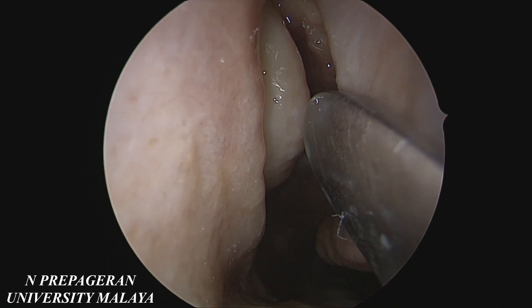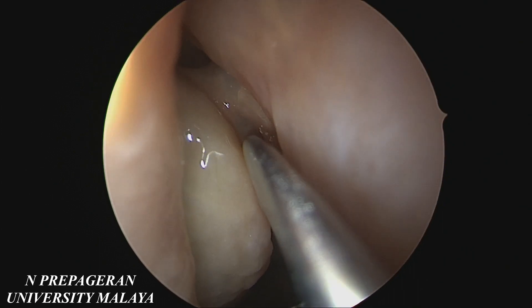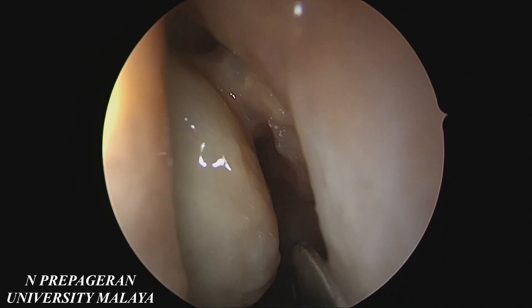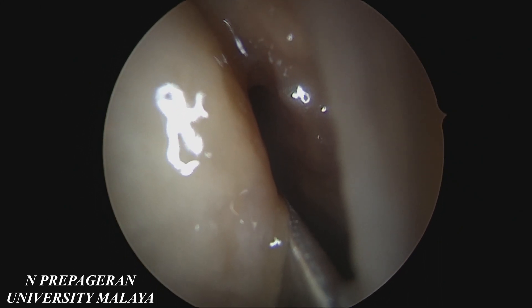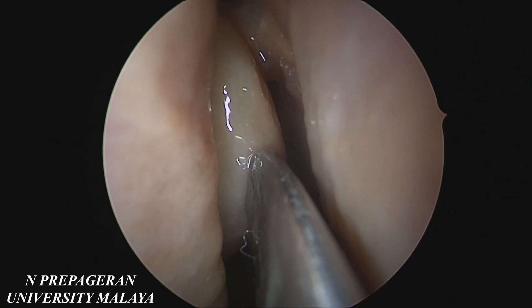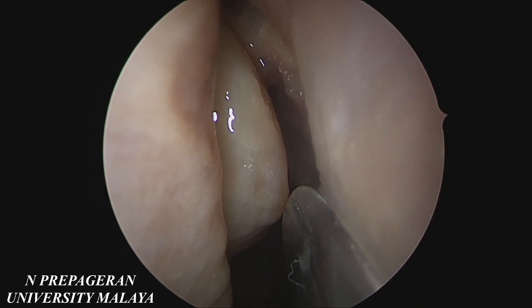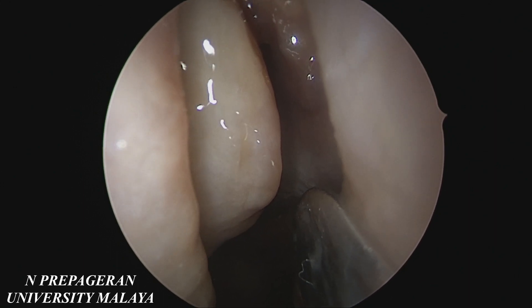Gate number 2, the bulla — you can have an air cell on top of it and that will usually form a suprabullar recess as you can see up there. You can also have an air cell behind that which will be a retrobullar recess. In the same way, the ground lamella or gate number 3 divides the anterior ethmoids, which usually have small cells around 11 to 15, from the posterior ethmoids that are fewer but larger inside.